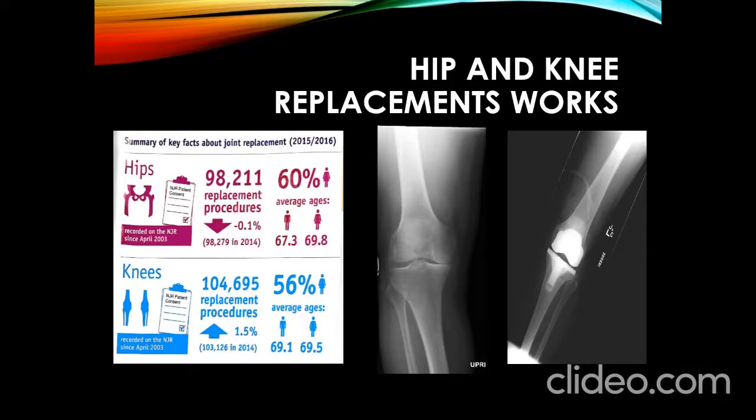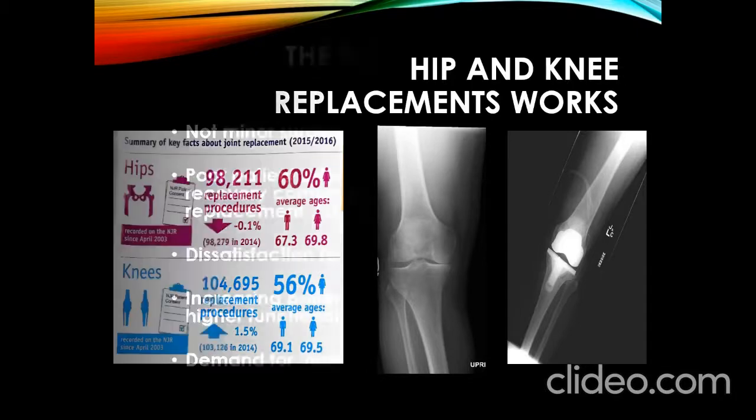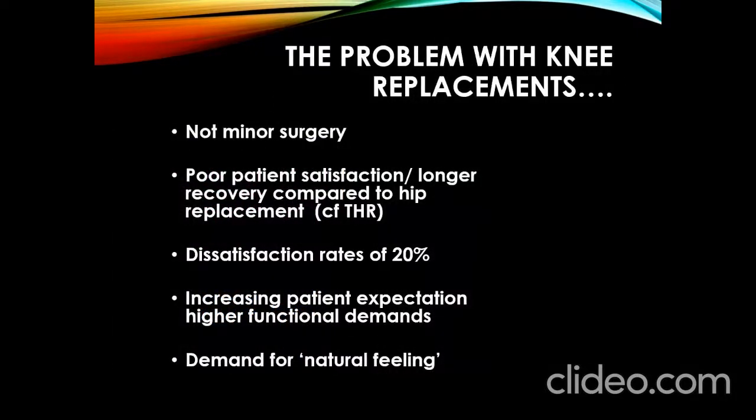So why robot-assisted knee replacement? Well, for a start, knee replacement is not minor surgery. Patients often complain that they take a long time to recover, and certainly when I do hip replacements, patients recover much quicker, and they seem to be a lot happier, much quicker. But the overall satisfaction from knee replacement is also much lower. The literature would report dissatisfaction rates of up to 20%. So 1 in 5 patients are not happy with their knee replacements.